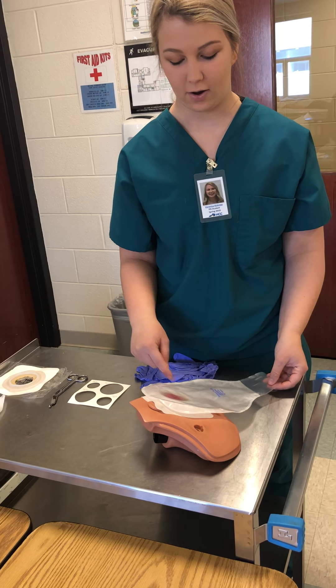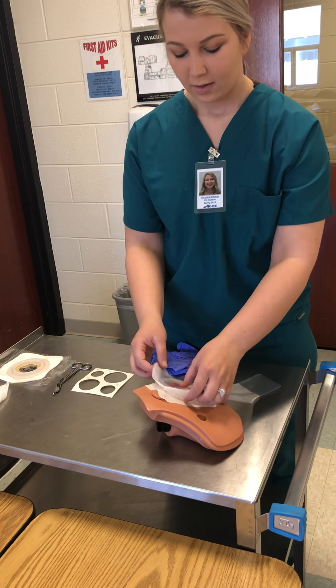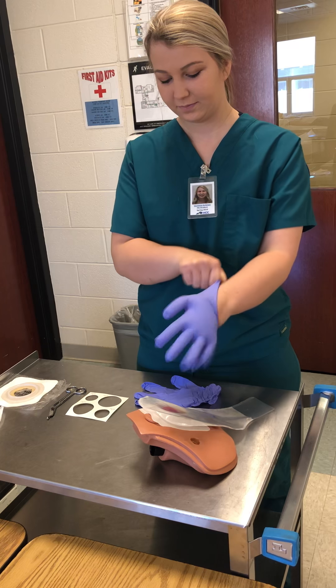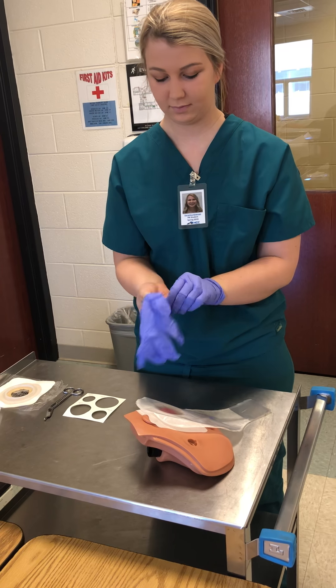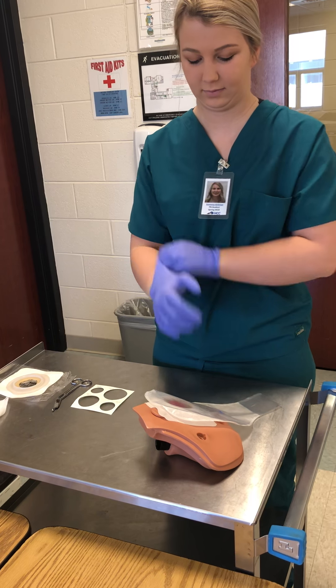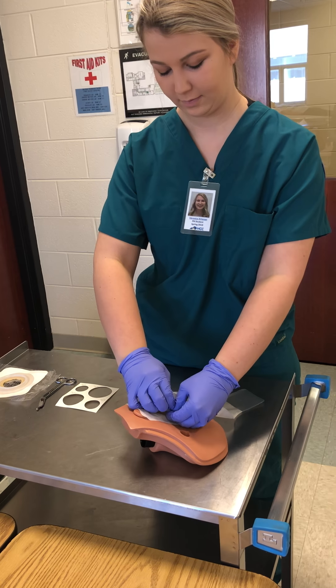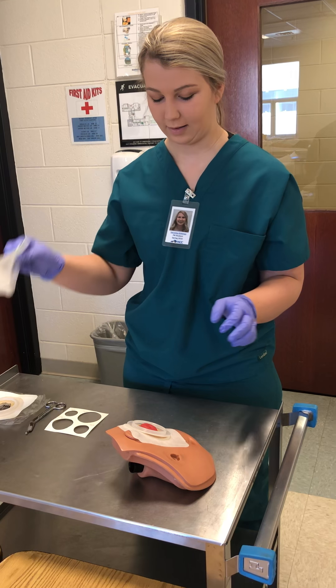I can either take this one off, clean it out, empty it and reuse it, or I can get a new one. So I'm going to put my gloves on. I'm going to remove this pouch and empty it. It's clean.